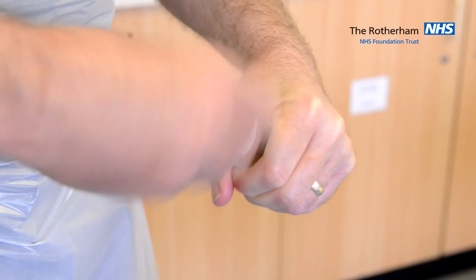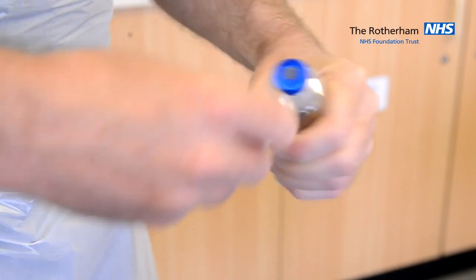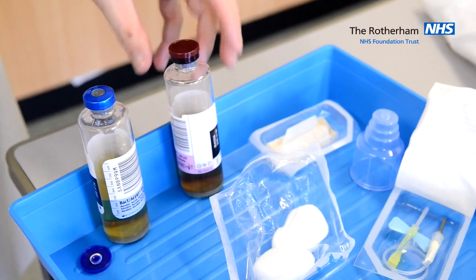Once you have finished cleaning the bottle top, allow it to dry and repeat the process for the next one.